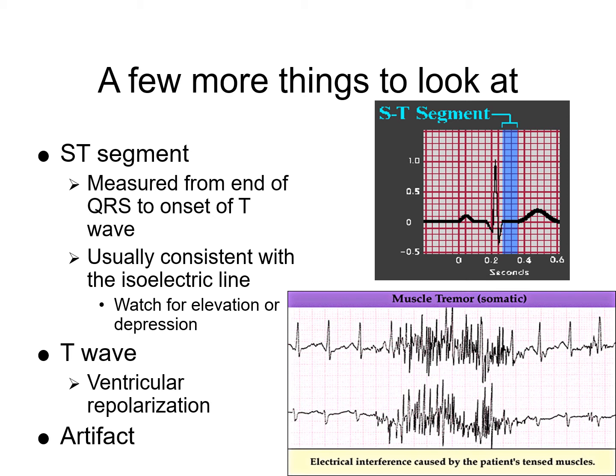I have all these weird ways of remembering things, but if you have an MI infarction elevated, I think that you're going up to maybe a different life. It's just one way of looking at it. So an elevation would be worse.